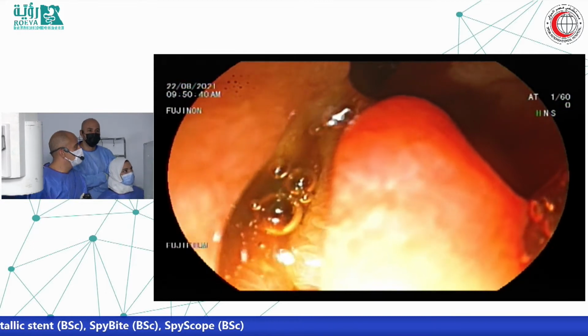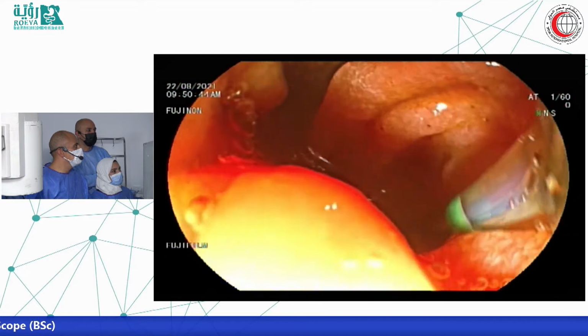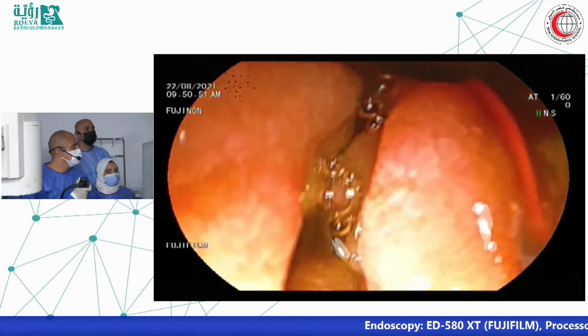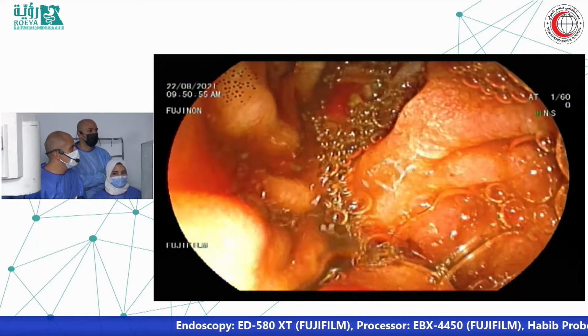So yes, in this case, Mostafa will do it differently. He'll put a guide wire first. I think this is always prudent and safe, and it actually saves time. Putting a guide wire makes the introduction of the spy smoother and safer actually.